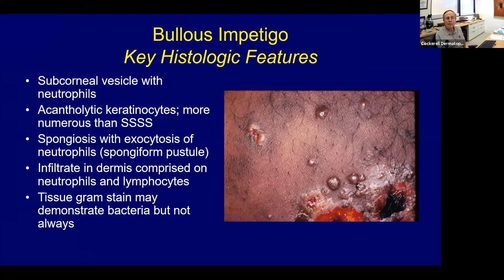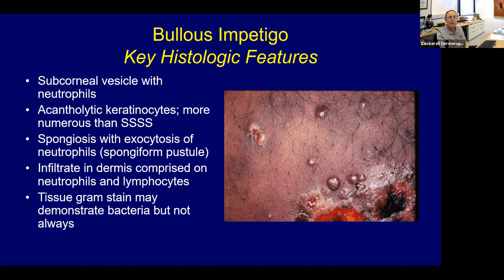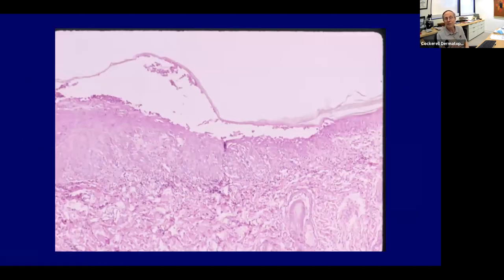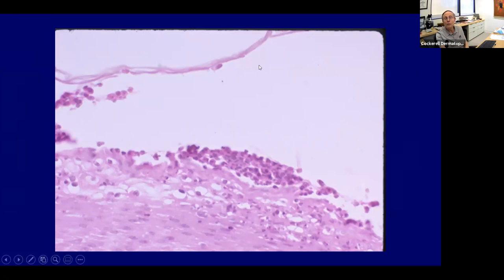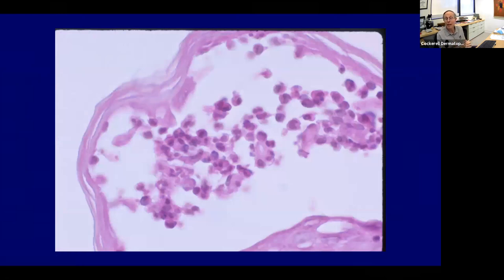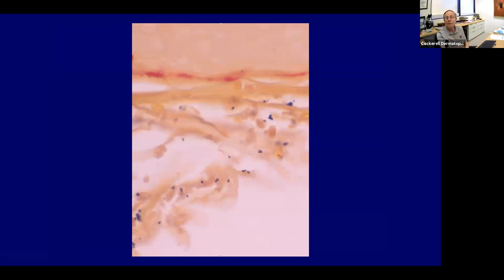Impetigo is caused by bacteria and gives a subcorneal vesicle with neutrophils and acantholytic keratinocytes — usually more than in staph scalded skin syndrome, which is associated with a circulating epidermolytic toxin. Here you usually see bacteria in the blister space, and a tissue Gram stain may demonstrate bacteria. It's a classic subcorneal superficial blister with neutrophils in the blister space. The differential includes superficial pemphigus and dermatophyte infection. These can be caused by methicillin-resistant or methicillin-sensitive staph.